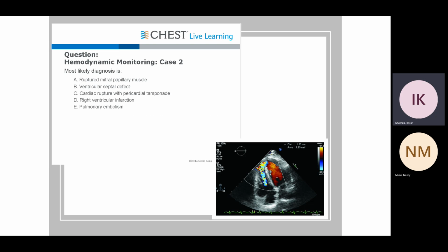That used to be common, maybe not so much these days after thrombolysis and PCI, usually with an anterior MI, two to three days into the course, and patients might go into cardiogenic shock with this picture. That goes with the new murmur from the VSD and the step up. When you put in your waveforms, this would be an example of seeing a large V wave on your wedge.